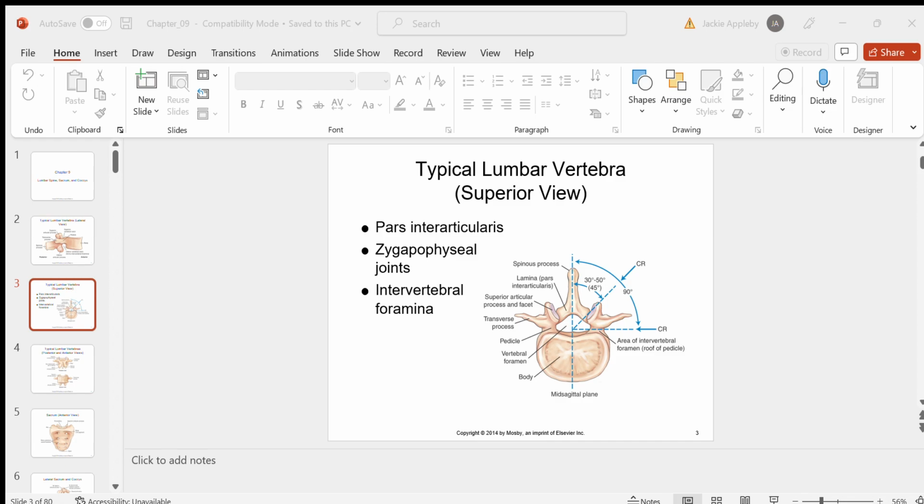We're looking from the top right now. So we're standing at the head looking down towards the feet. Which one of the oblique positions does the patient need to be rotated into for this left side to be shown? So we're rotating the patient this way. This is their left. That's their right. I'll even give you that. It's the right oblique.